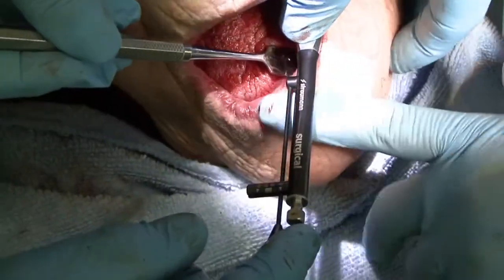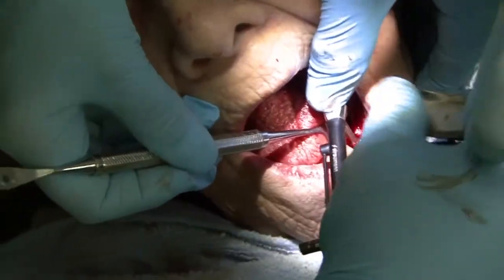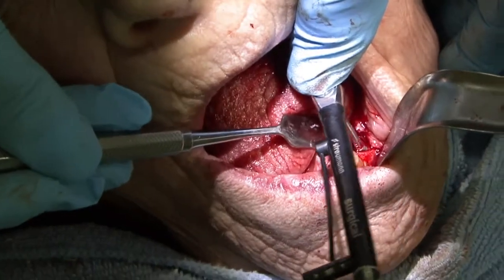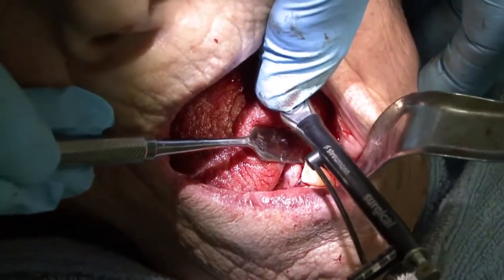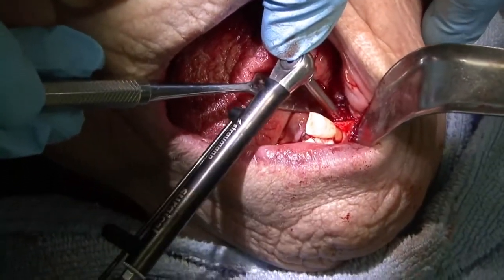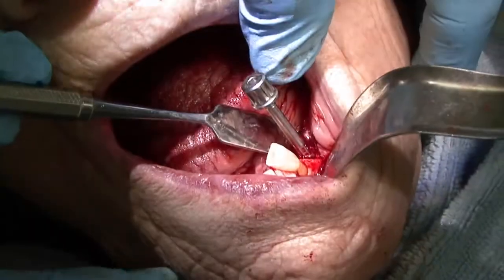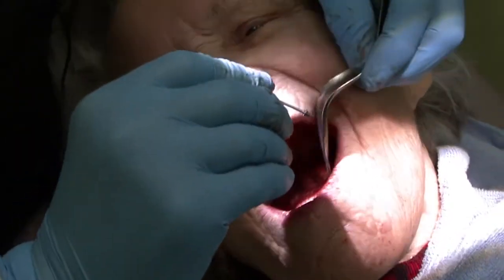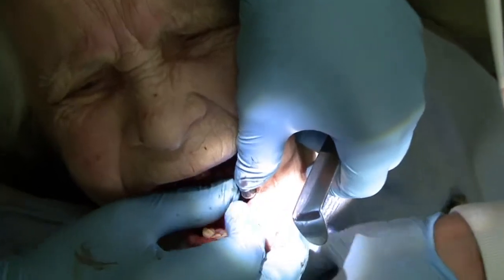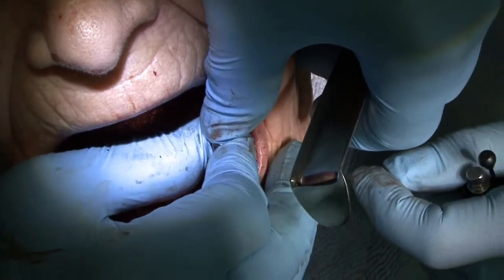Bring the mirror or the retractor there. Take the Minnesota retractor. Great. Now, okay, let's take a look at that and see how it is. That's tight.